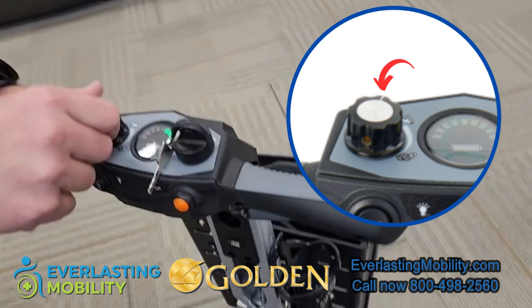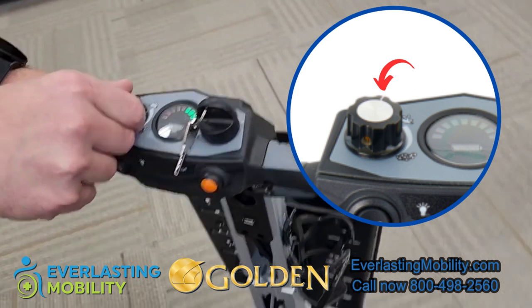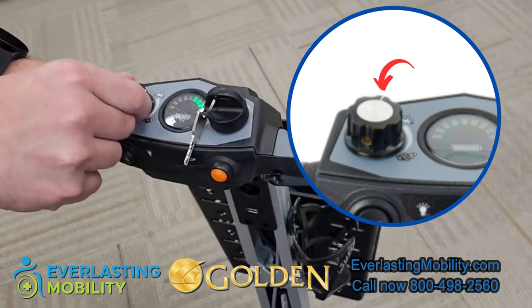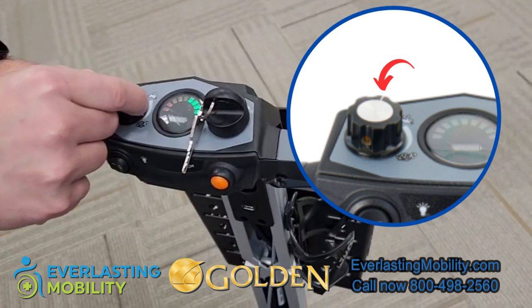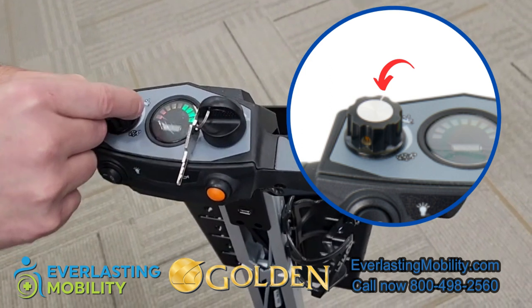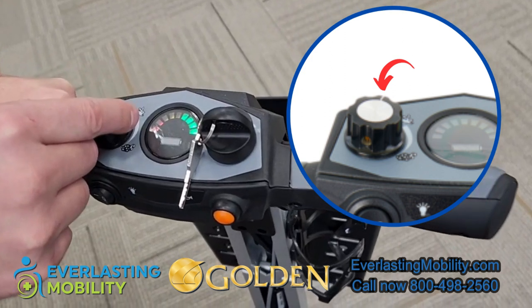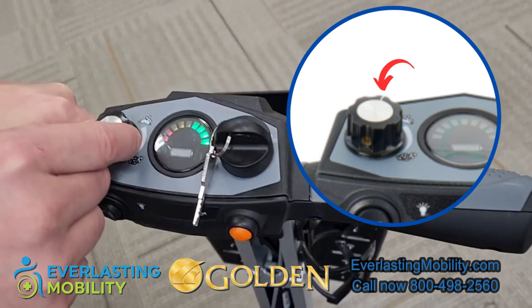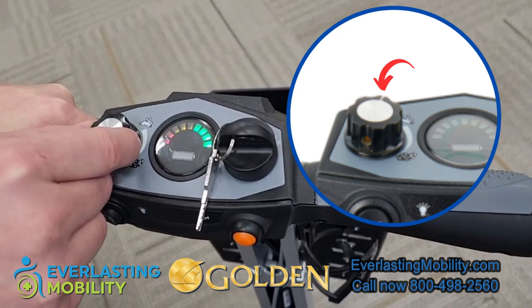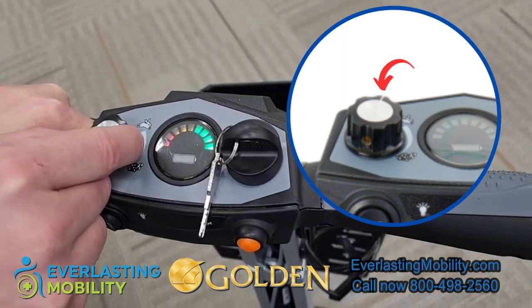This is the speed dial. If you're going through crowds you might want to turn it down to the turtle setting, where your top speed is around one and a half to two miles per hour — useful in a grocery store, for example. If you're in the open and trying to get somewhere quickly, you can turn it up to the rabbit setting for maximum speed of around four to four and a half miles per hour.